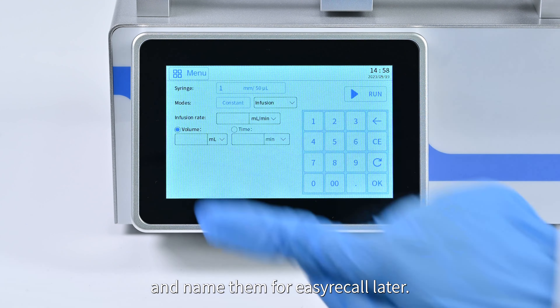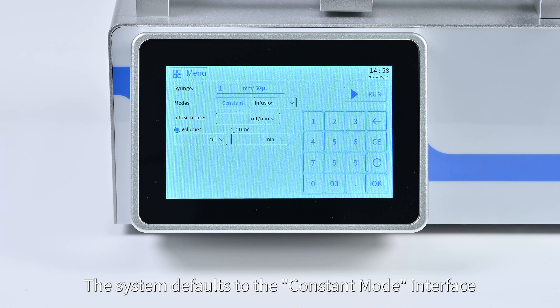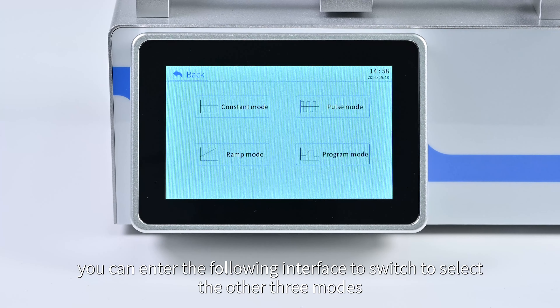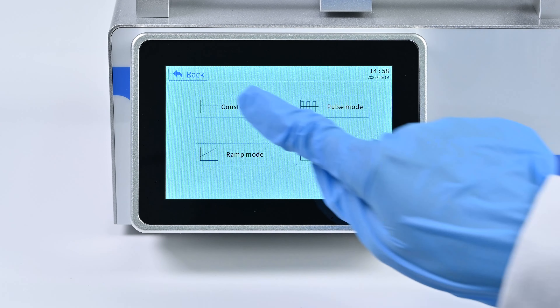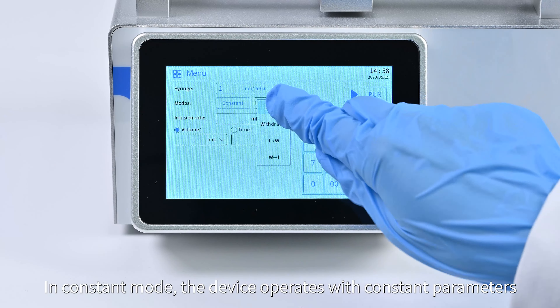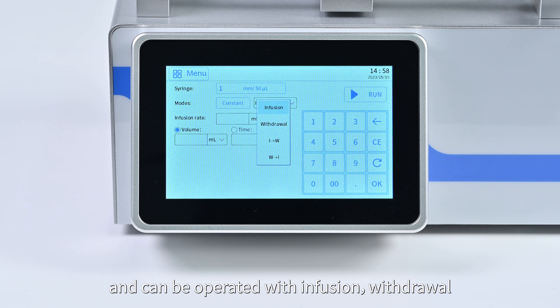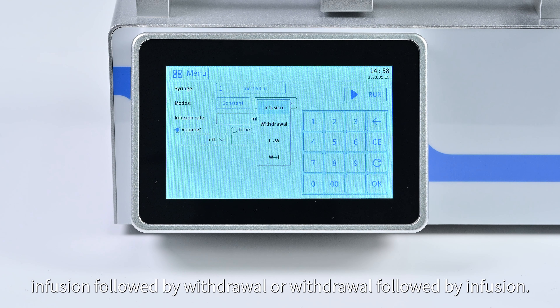When finished inputting settings, click 'Save As' to save and name them for easy recall later. The system defaults to constant mode interface. Click 'Constant Mode' to enter it, or switch to select the other three modes. In constant mode, the device operates with constant parameters and can perform infusion, withdrawal, infusion followed by withdrawal, or withdrawal followed by infusion.